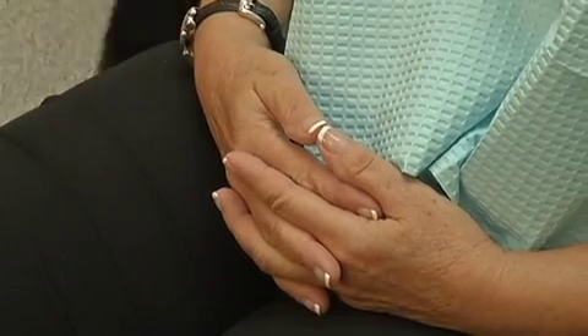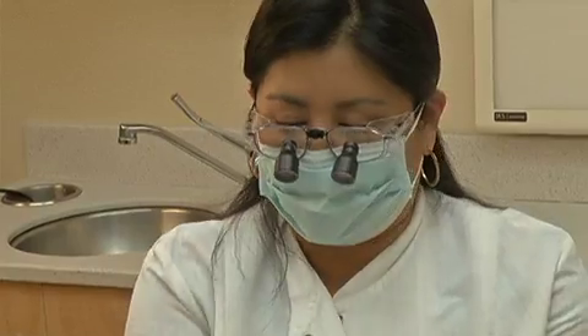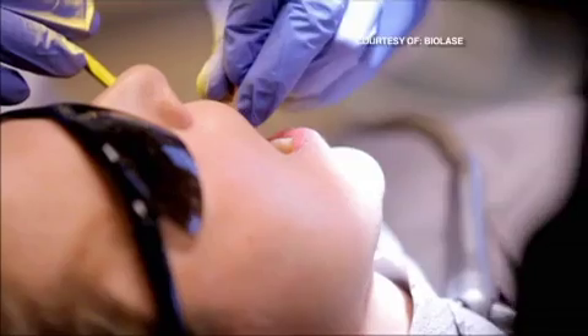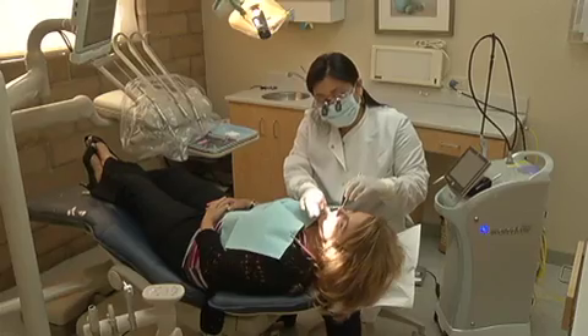I have receding gums. To fix Terri Pesta's problem, her periodontist used a laser to transfer tissue and fill in sparse areas of gum. Terri had the procedure performed without the laser the first time, and then with it. She said: this time there was absolutely no pain at all. A technology that is changing the way dentists treat patients, and the way patients feel about seeing their dentist.